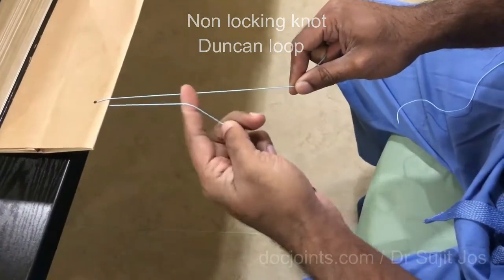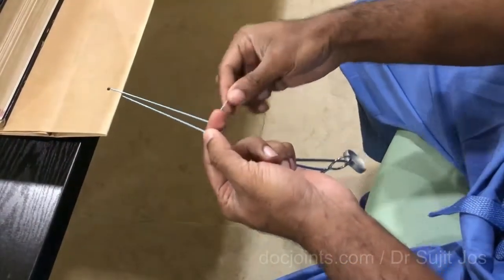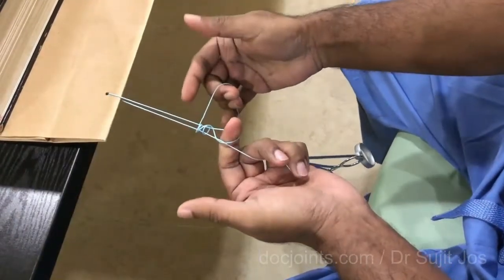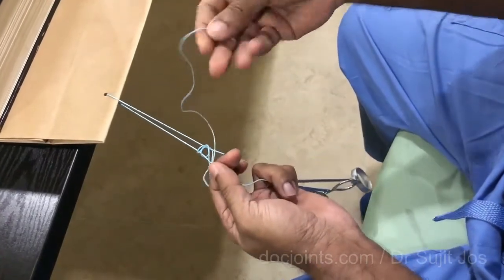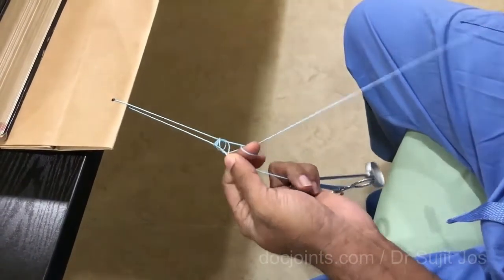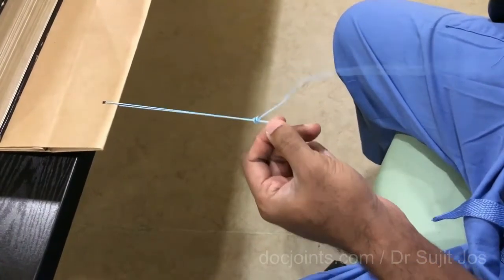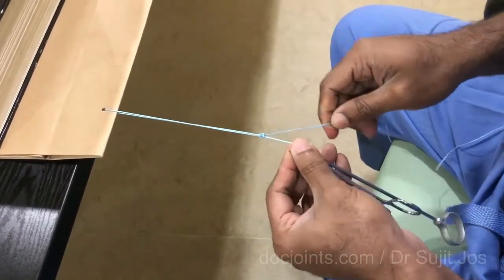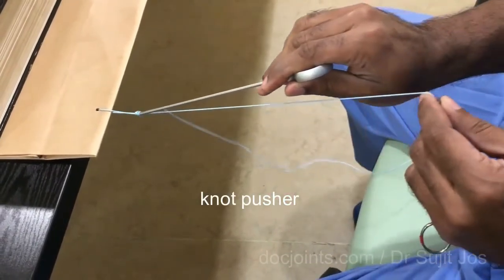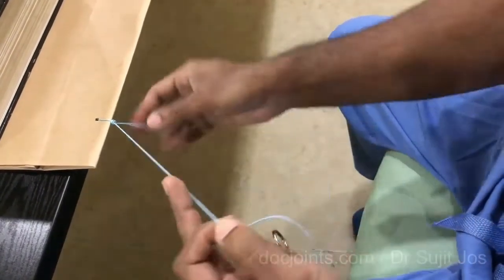Keep a finger under the thread and pass the thread over the hand. Three knots — three rounds over the two limbs of the loop. Then pass the thread through the loop just near your finger. Now leave the finger and tighten this. Hold it tight and use the knot pusher to push the knot into the area you want to tighten. Now this is tight.